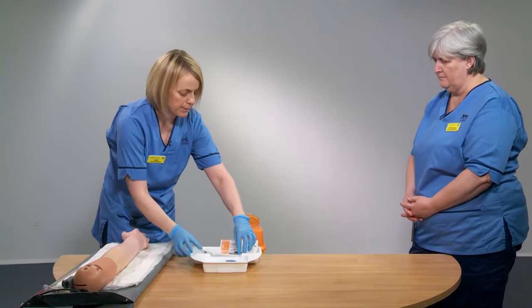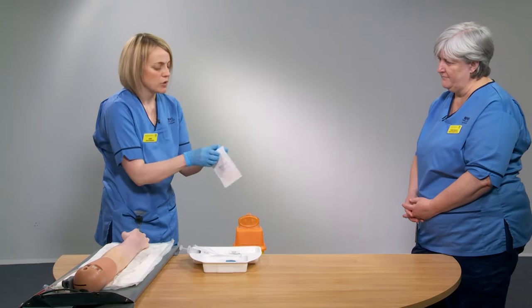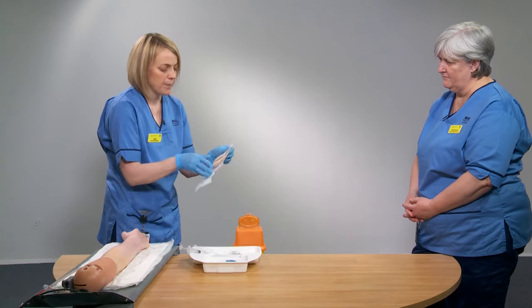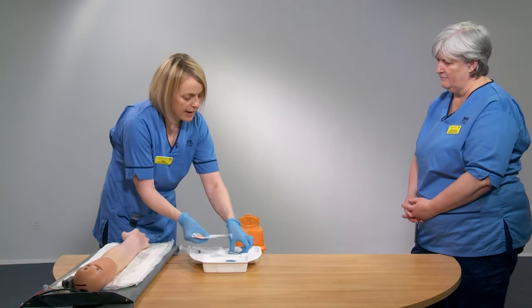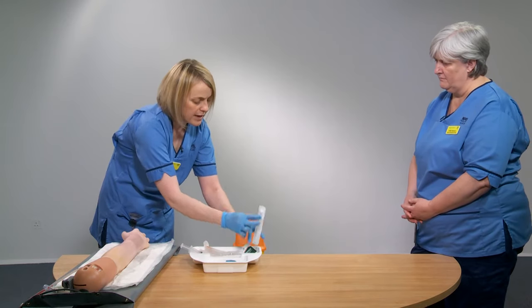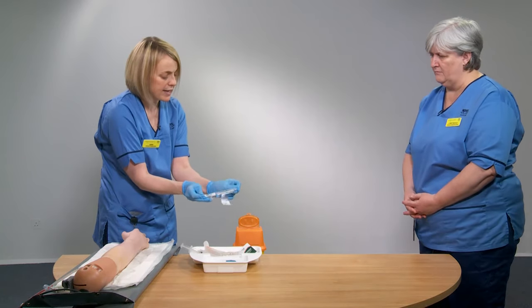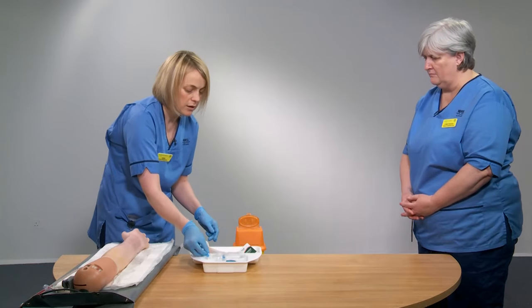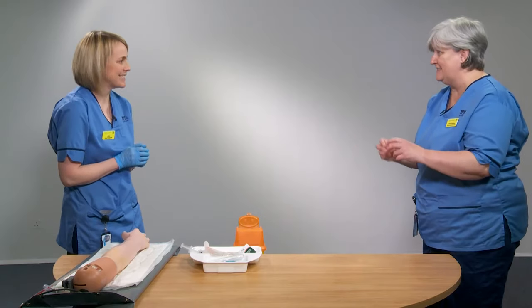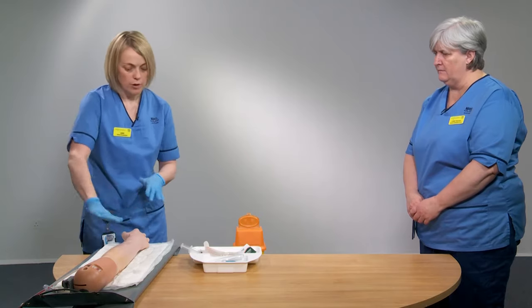The next thing you want to do is prepare your dressing. Peel open your dressing and keep that on your tray ready to use. Then open up your cannula and keep that in its sterile packaging until you are ready to use it — that non-touch technique of using the sterile packets maintains the integrity of the contents. Now that everything is prepared, we can think about decontaminating the skin.